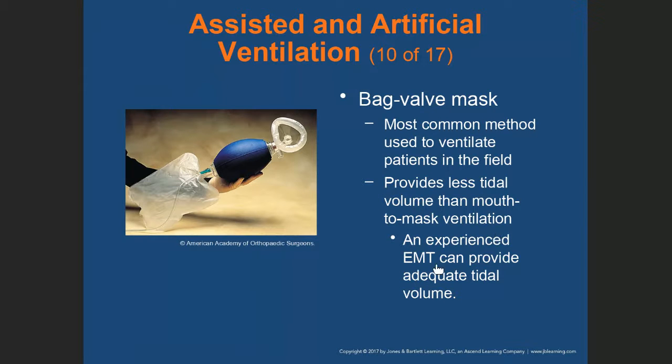An experienced EMT can provide adequate tidal volume, but an inexperienced EMT can become your worst nightmare in the field for managing an airway if they don't know what they're doing. And I have had a few. So an EMT that is very comfortable with a BVM is the best thing I can have on my team. They will make my job easier. An EMT that doesn't know what they're doing is going to create all types of problems for the airway.